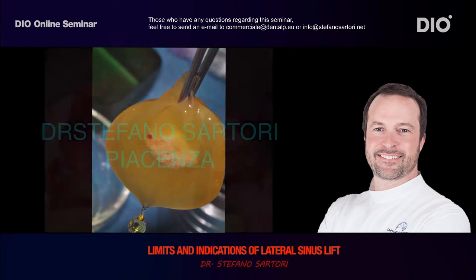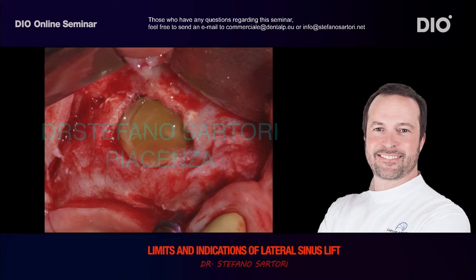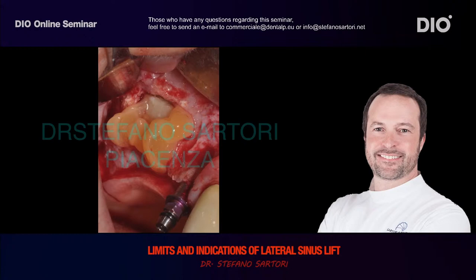the window, but before you have to cover the perforation of the membrane, if you have a perforation, because sometimes when you have these failures, you don't have a perforation of the membrane. If you have a perforation, as in this case, before you close the perforation with the PRGF membranes, and then you position the core, the block of bone inside the window. But how to do it? You have to square the hole.